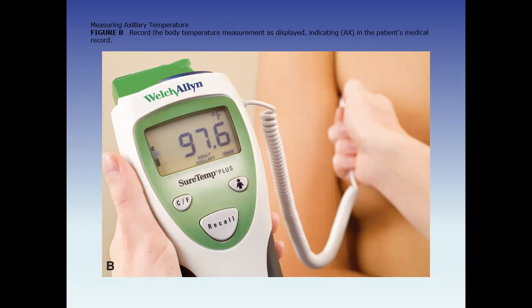The Fahrenheit is 97.6, so that means it's a normal body temperature.